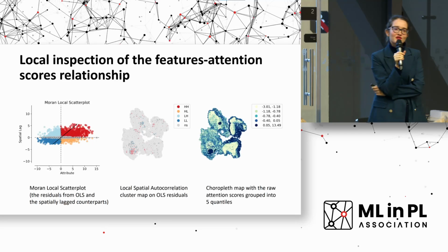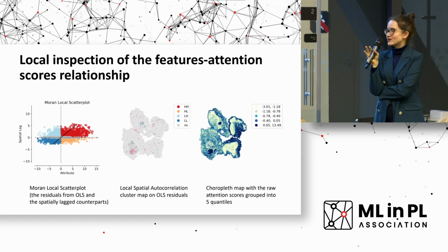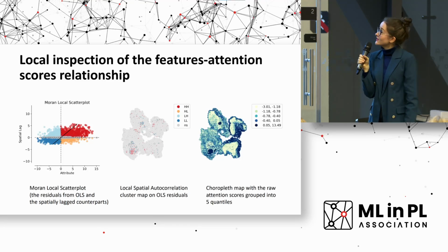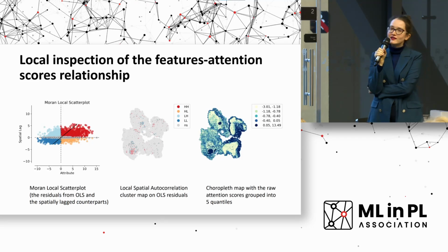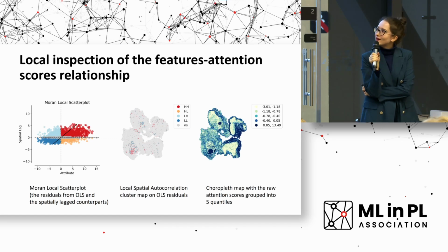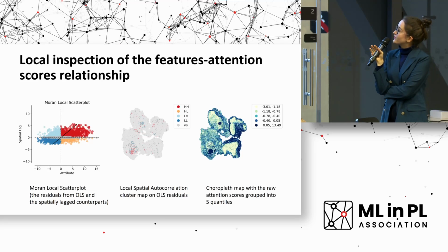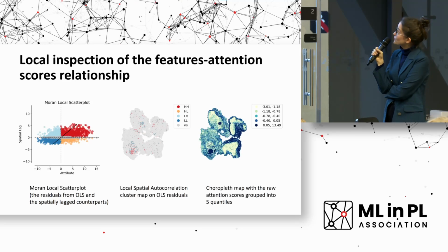So far, we used the spatial statistics to analyze everything in a global sense. So we expressed a whole big image as one value. But it doesn't have to be like this. We can also use these methods to analyze the images, still keeping the spatial aspect and having it visual. So we can apply this Moran test that I did at the beginning to test whether we can use spatial regression, also in the local form, where we still have the value for each patch individually. So later on, we can get such plots to analyze whether there are some clusters.